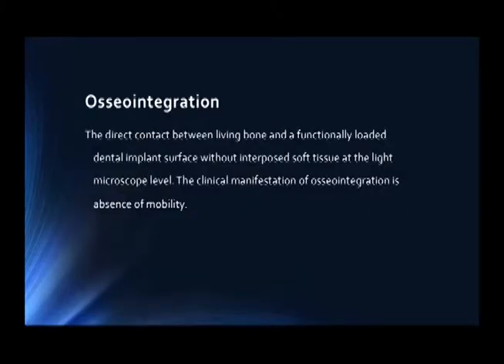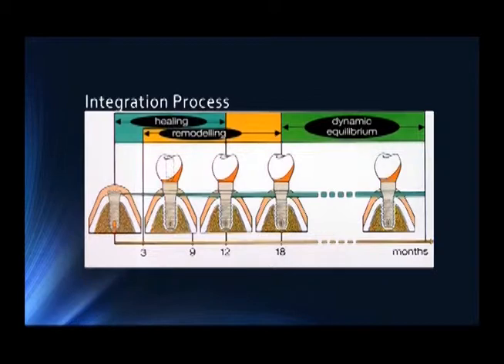Okay, so we're going to define osseointegration. It is when the living bone is actually attaching to the implant. And when you've reached the absence of mobility, then it has been integrated. As you can see from the integration process on your slide there, over time it integrates into the bone and the implant threads.